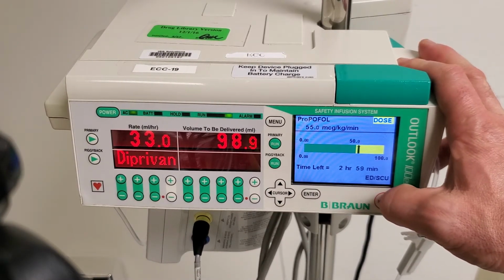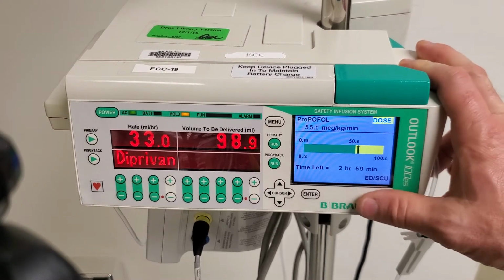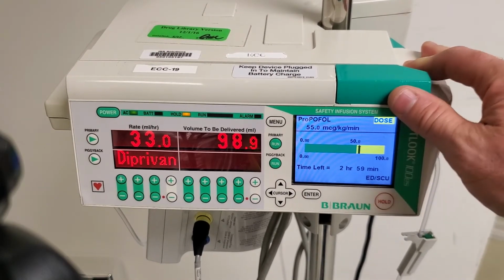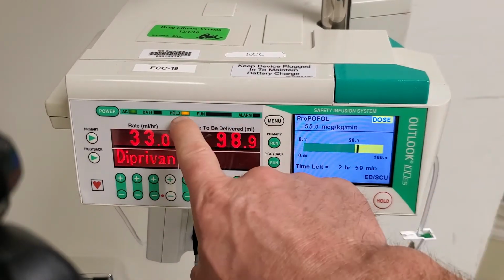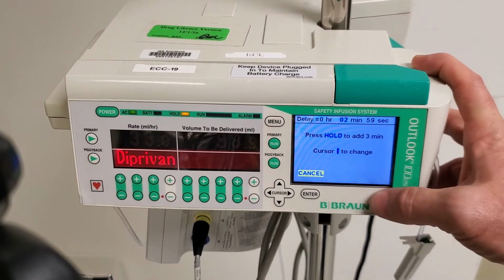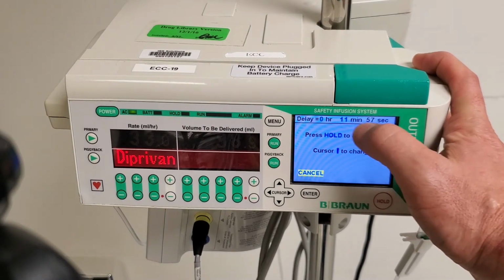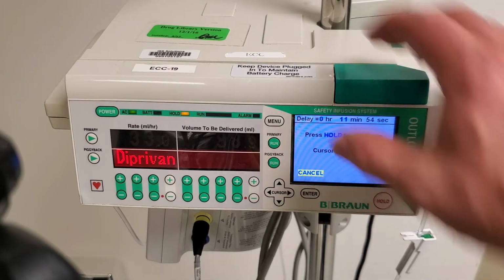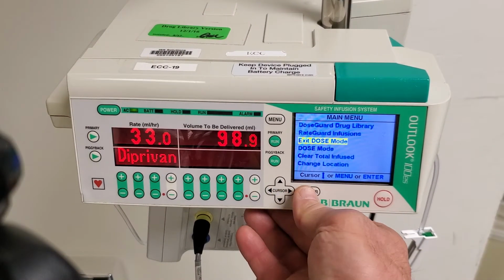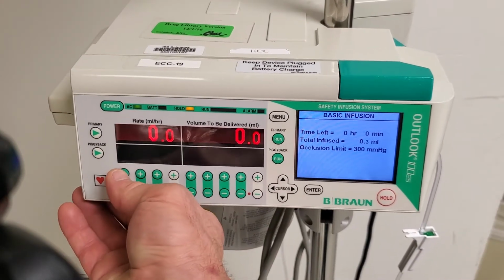The next thing we're going to talk about is a piggyback infusion. To stop any drip and to change modes, not likely that you'll need to do this, but you'll need to stop infusions. You press the hold button and it goes into hold. If you need to go into hold for more than 3 minutes, you just keep hitting the hold button. Now the pump will stay in hold for 12 minutes. Once the pump is on hold, you can exit the dose mode and it goes back to basic infusion. So let's set our basic infusion back up.